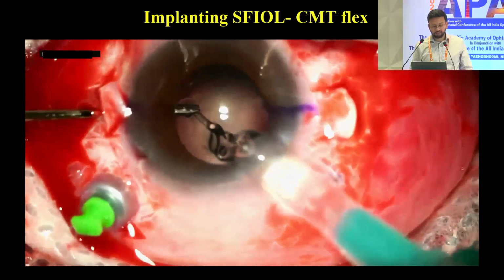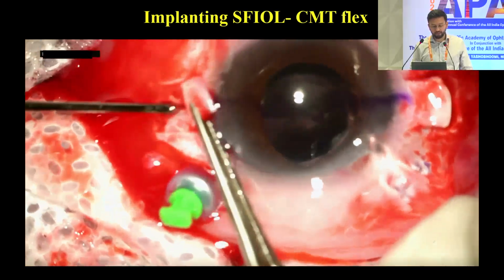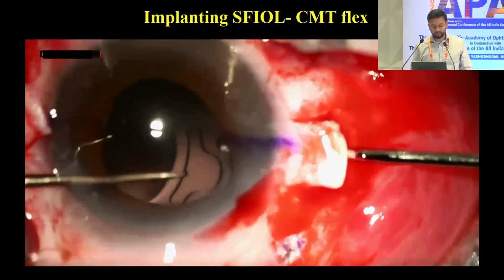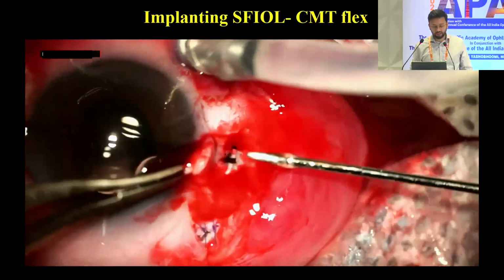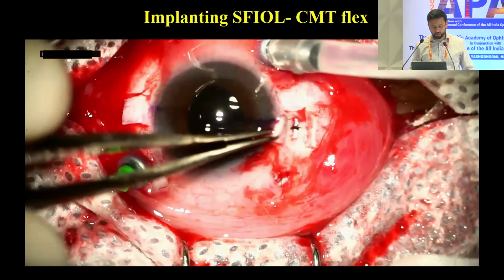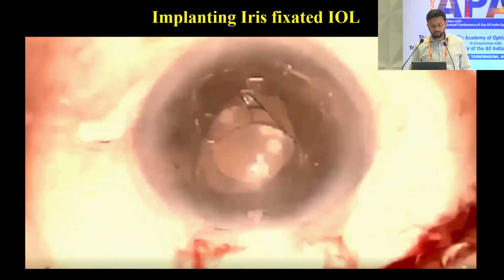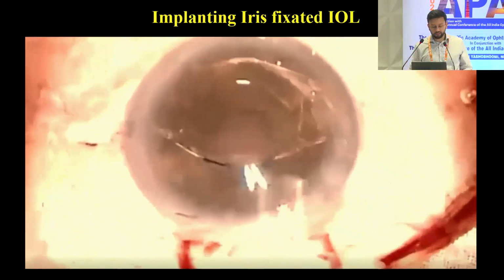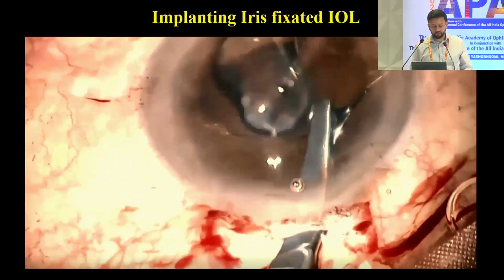So recently I have shifted all my secondary IOLs to CMT Flex because of the ease of handling the lens. It's a quick procedure and the centration is also very good. So the second haptic comes out, and then we can seal these scleral flaps with glue, or we can also suture it. We can also implant iris fixated IOLs, either in the anterior chamber or like in this one, we can fixate it posteriorly as well, behind the iris.